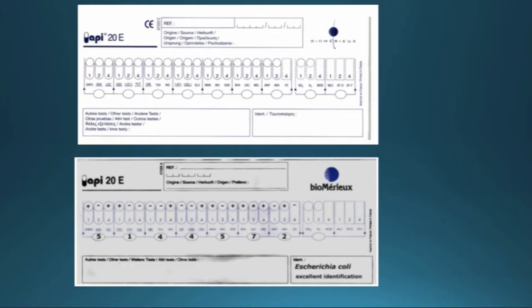Now you have all your reactions complete and you can start reading them. You want to transcribe your results onto the API sheets that come with the kits. Each positive reaction is assigned a number value, and in each section you add up the number values of positives, which gives you a code. You then go onto the API website, enter your code, and it will give you an indication of what your specimen is.